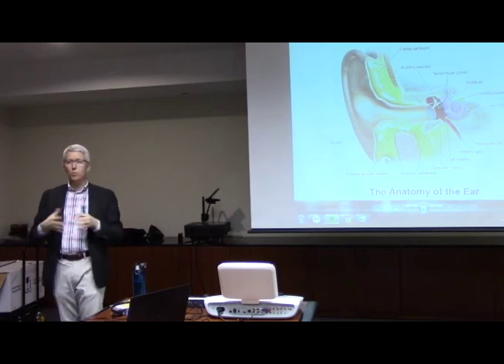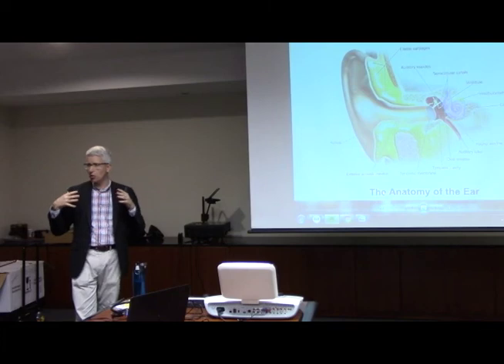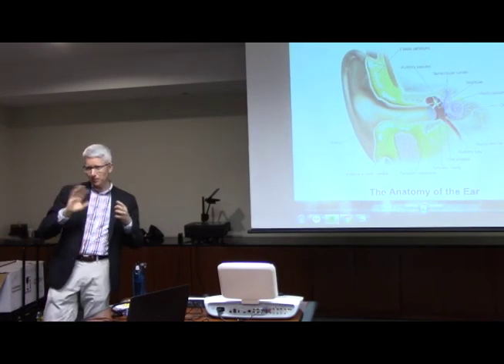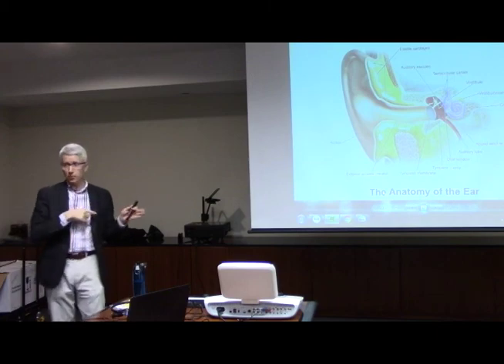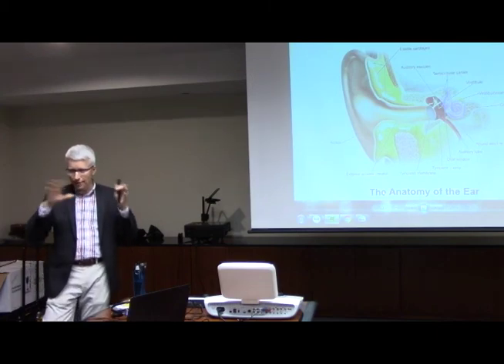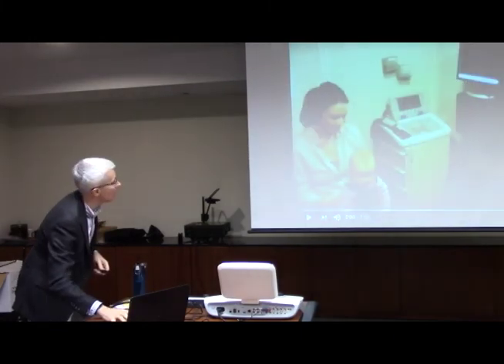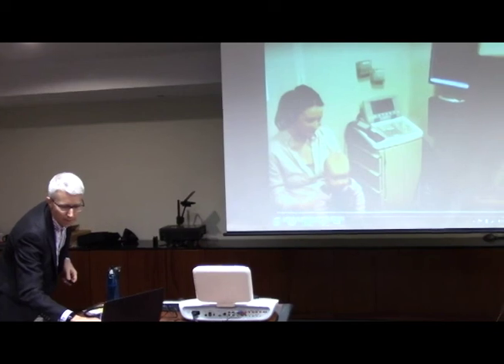The whole point of the sound booth is to keep things quiet enough so that when you do the testing, you know it's accurate and not affected by outside noises. I'll talk more about this in another video and bring in some different pictures. But I wanted to mention it because what I'm going to show you here is being done in a sound booth, so you can see it's a small room. I'm not even going to pay attention to the sound on this because it's not really the point. Let me mute this, and I'll narrate.